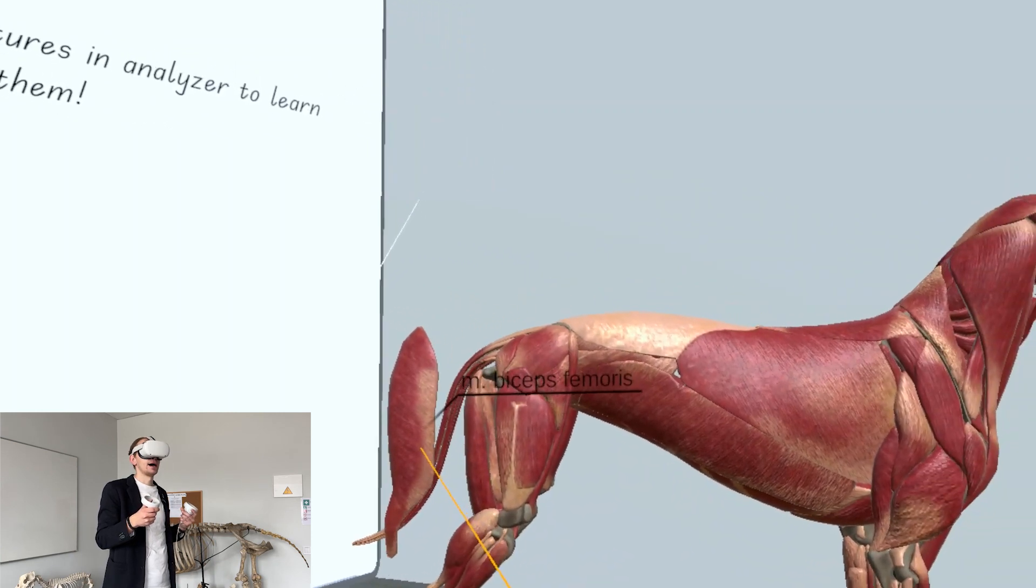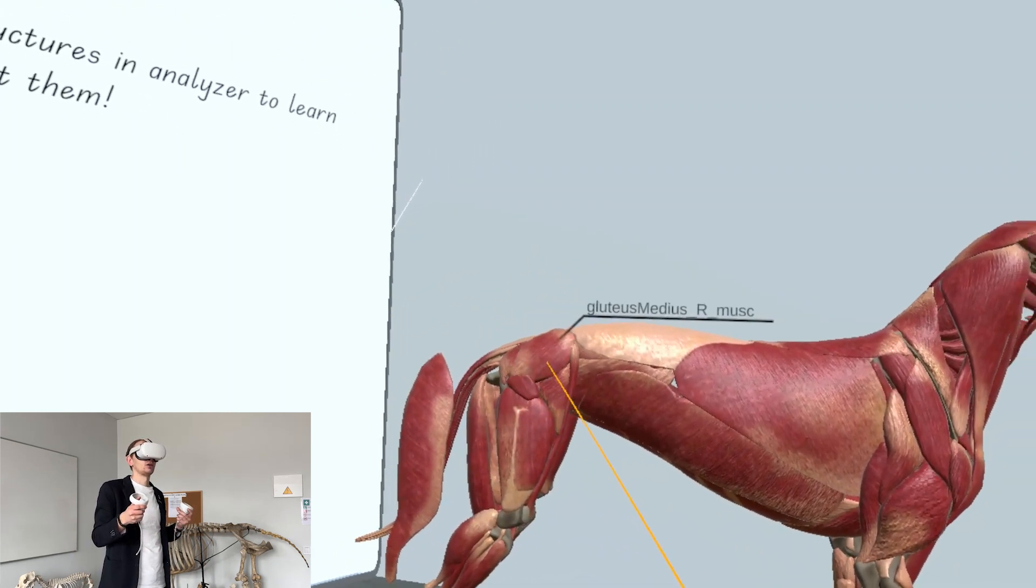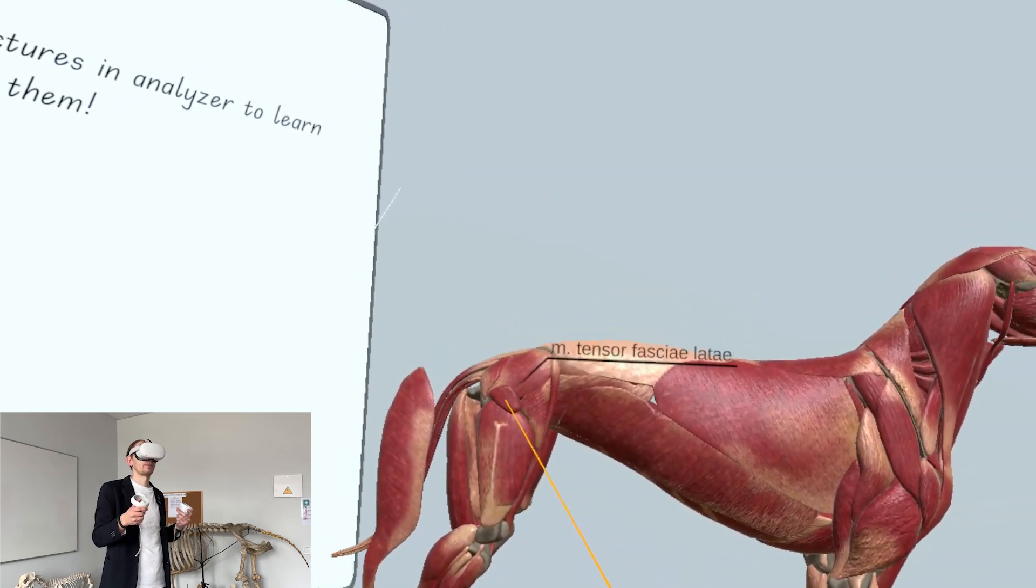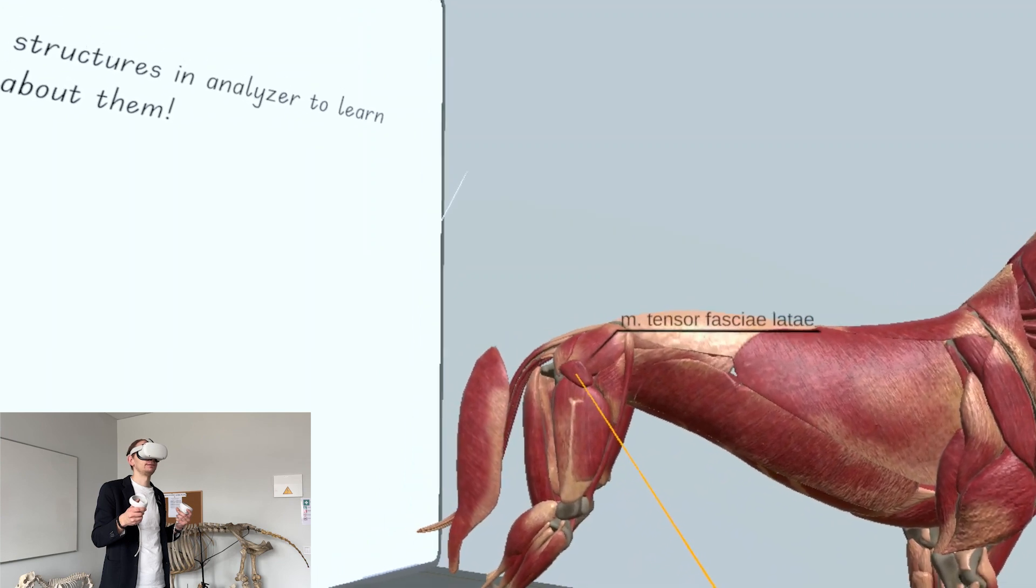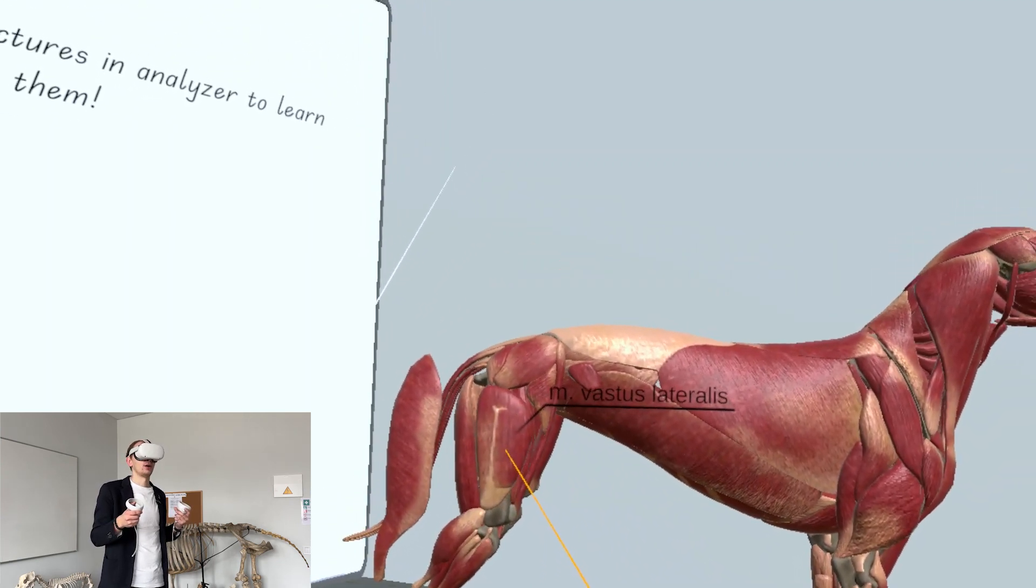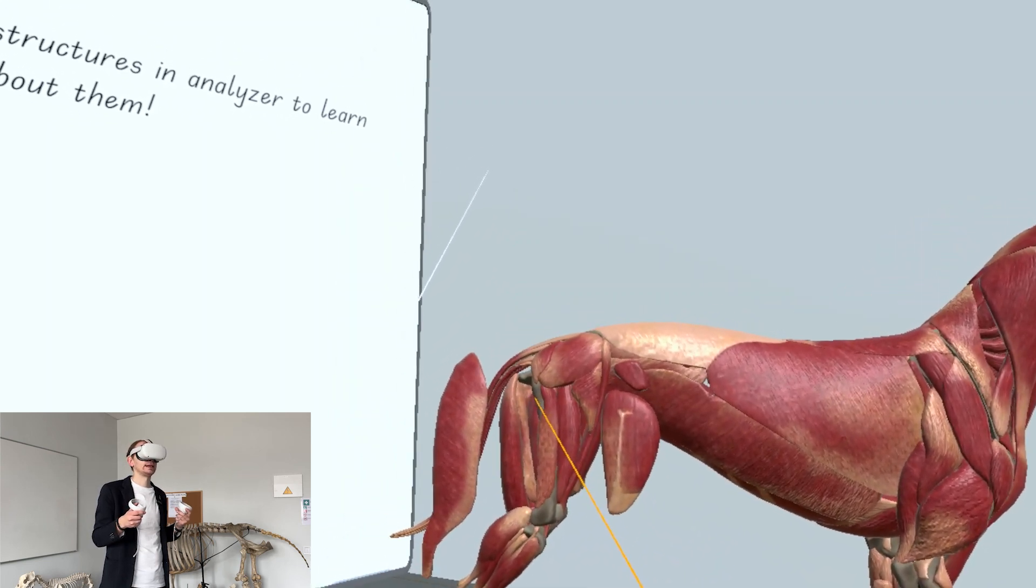We need to push it aside. Also, we have the gluteus medius and tensor fascia latae that we need to put aside. We need to cut through the vastus lateralis muscle, and that's how we get a better view of the femur.